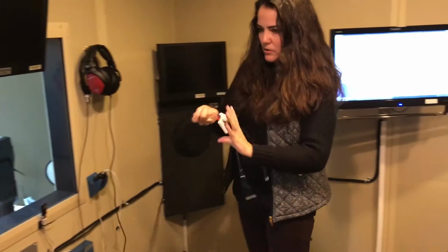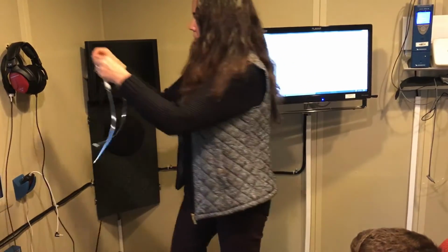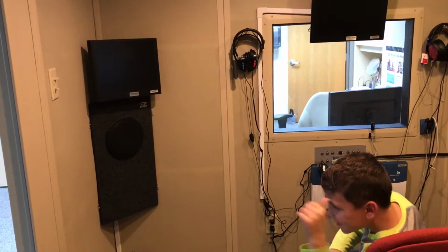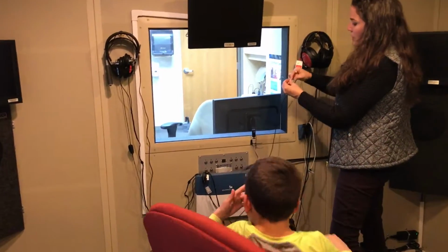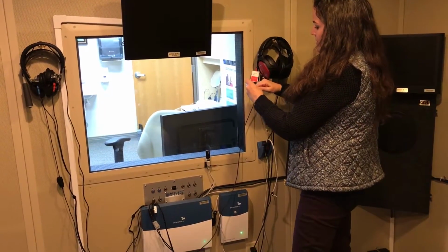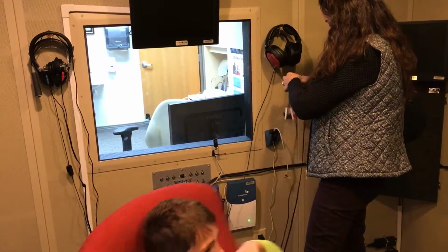These are the insert earphones that we place inside the patient's ears. Actually, I need to grab some tips for that. Insert earphone tips are disposable, so you get new ones for every patient. You'll put them on the very end. For diagnostic testing, we usually use insert earphones.